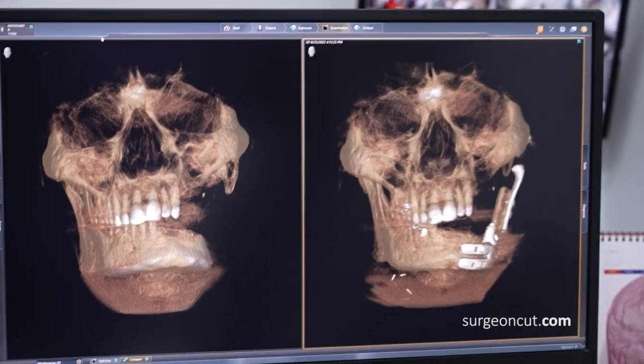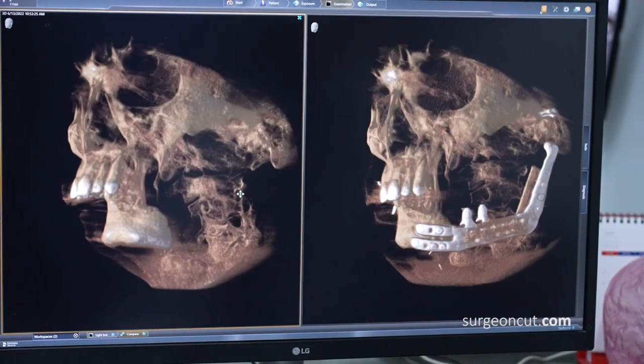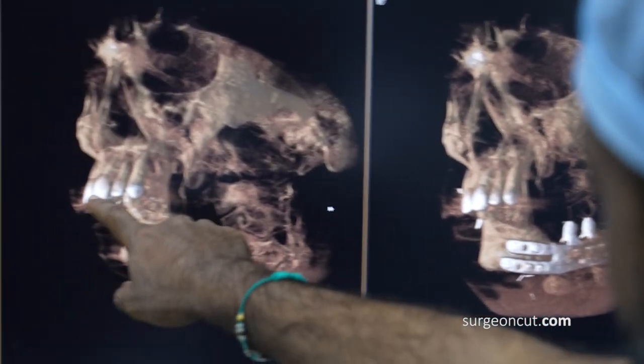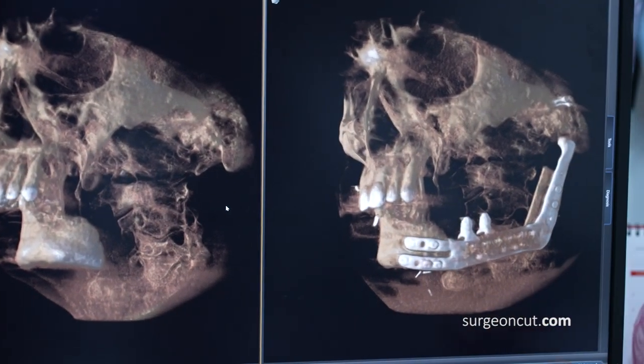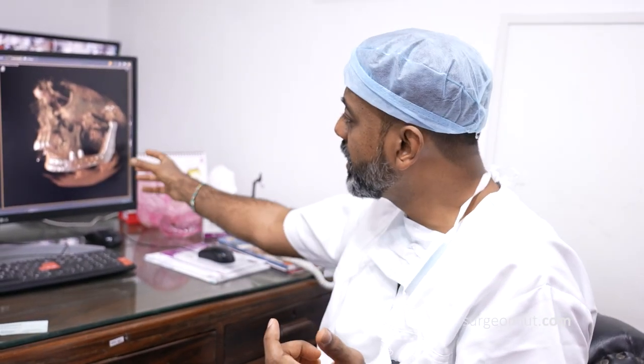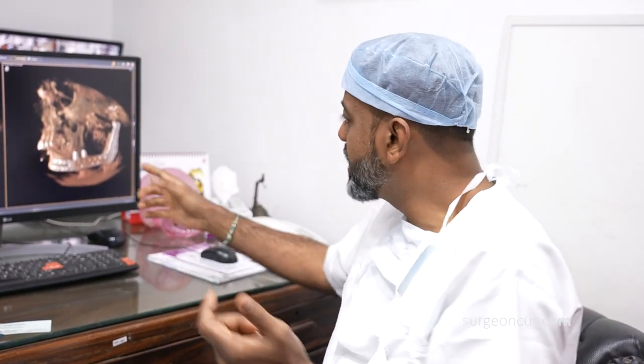Yeah. So now you have a direct one-on-one comparison and you can see the improvement. Look at the distance of the chin from the teeth, because this had totally collapsed. And then we have this entire prosthesis now. So this is what we call a temporomandibular joint prosthesis or a joint replacement. I'm sure most of you have heard of knee replacements and hip replacements also. So we also have temporomandibular joint replacements, though it's not done for a lot of patients. But yes, when you have the right indication, it's a big boon for patients because it can give back their chewing ability. It can make them get back their ability to open the mouth. And most importantly, it also gives them facial symmetry in a very severe kind of a case like this one.